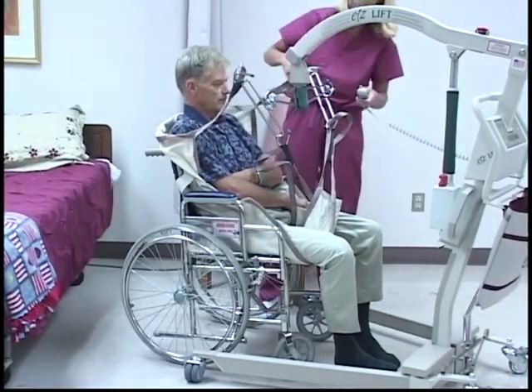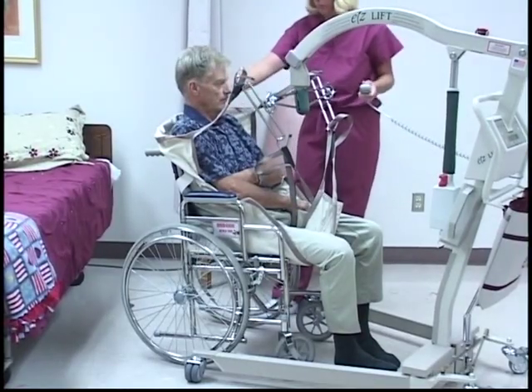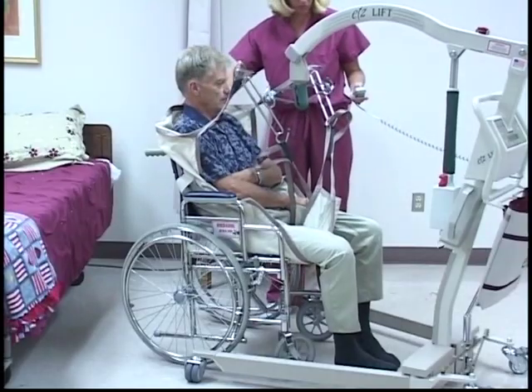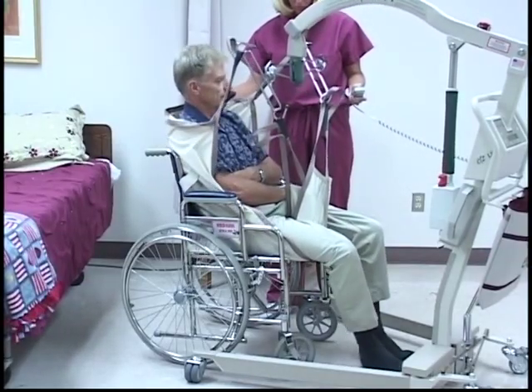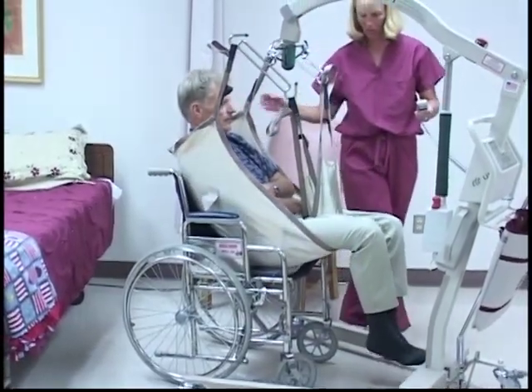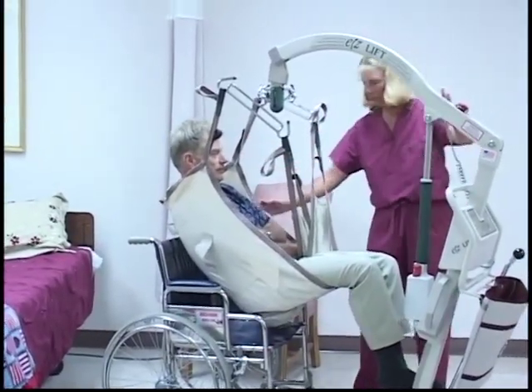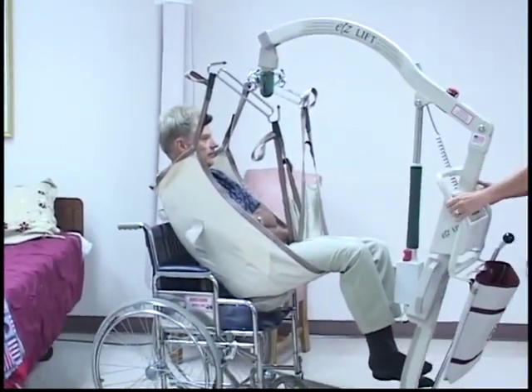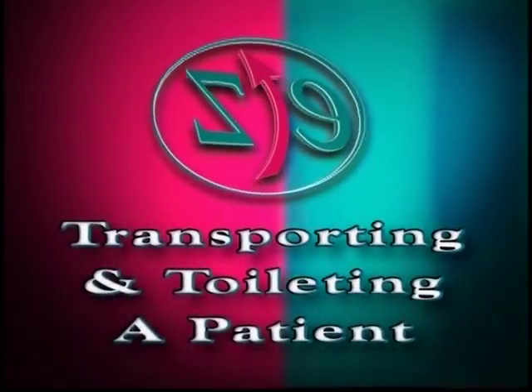Push the button on the hand control. Lift until there is tension on the wings of the sling, making sure all of the loops on the sling are securely hooked on the sling hanger. Then smooth the sling's wings under the patient's thighs with a slight pull on the outside seam of the wing. Lift the patient off the chair. Once the person has been lifted, they are ready to be transported.